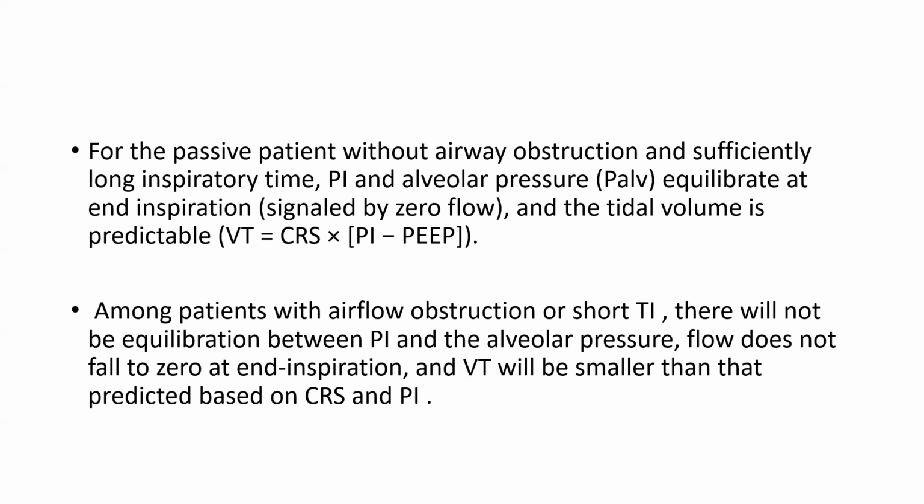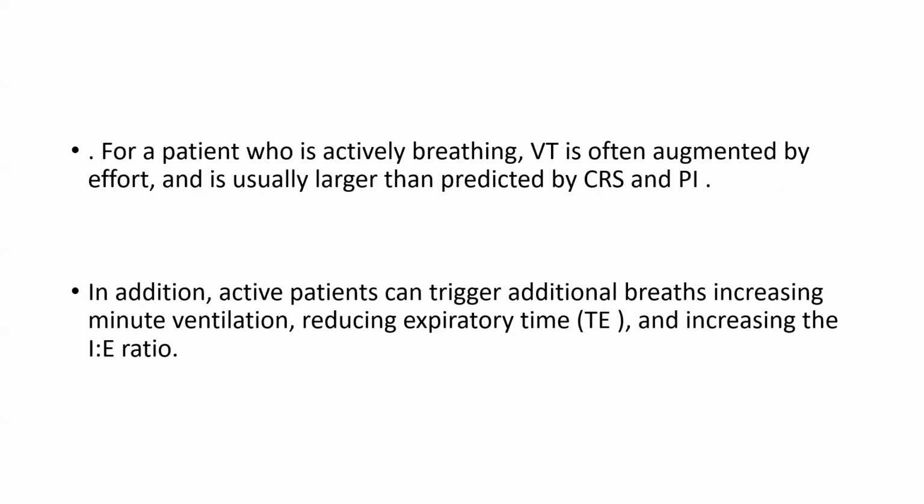The tidal volume will be smaller than predicted because it is based on the compliance and the inspiratory pressure. For a patient who is actively breathing, the tidal volume is often augmented by the effort and is usually larger than predicted by compliance and inspiratory pressure.